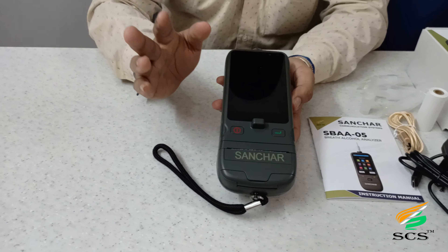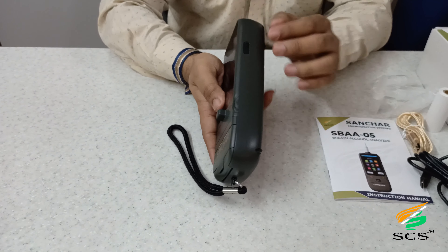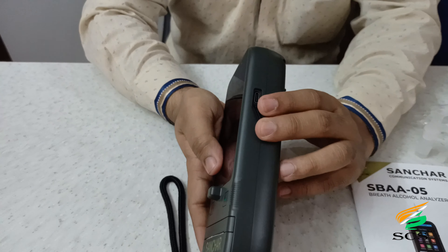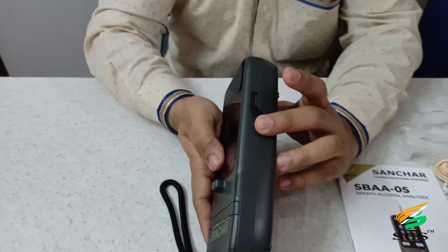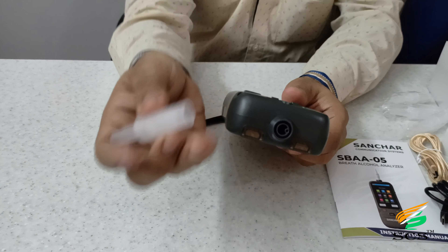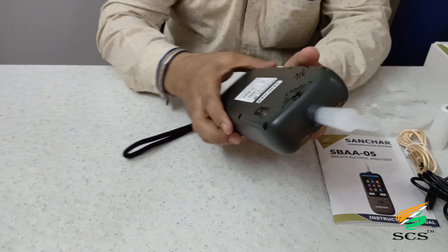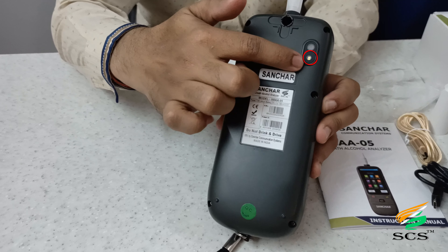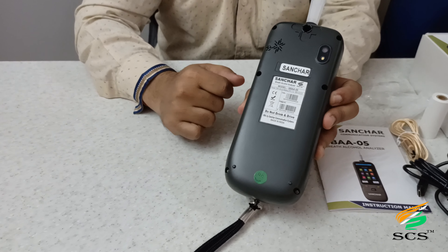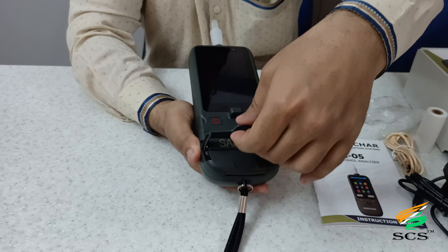The device features a color TFT LCD touch screen. This is the power on/off button and this is the back button. This port is for charging and data transfer to PC and laptop. You need to put the mouthpiece into the sensor like this. This is the back camera and this is the torch.